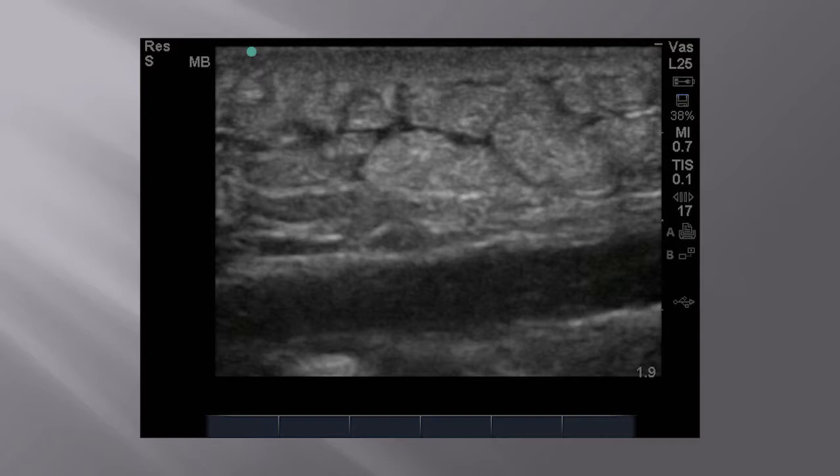There's your epidermis there. You start to see some of your muscular interface down here. So I know this is a superficial abscess, but it's not ripe yet. You got a little bit of fluid there. Here's your pus there, a little bit of pus collection.